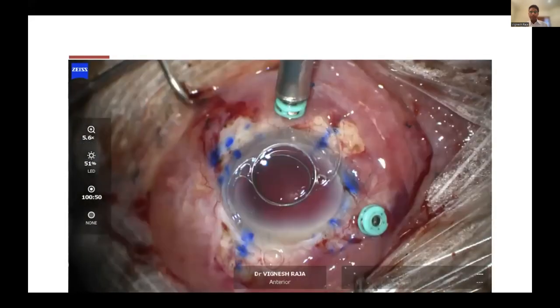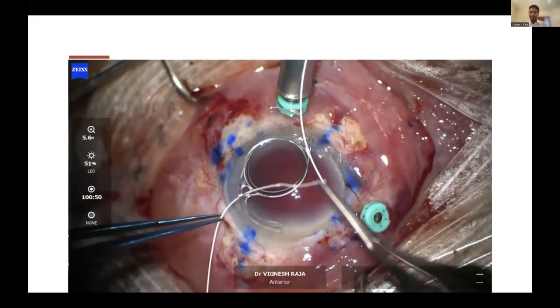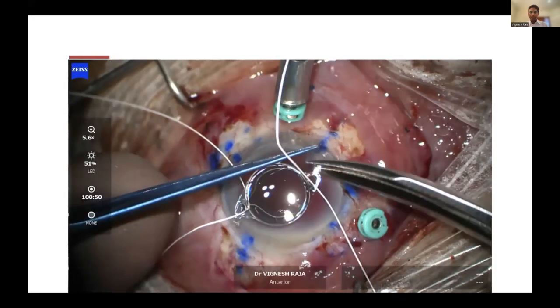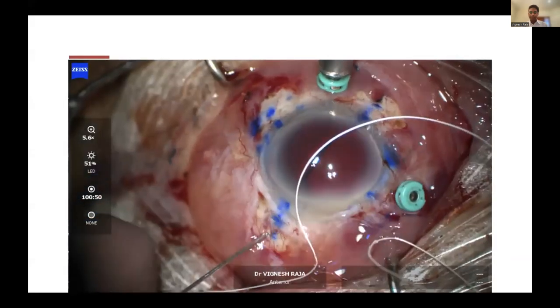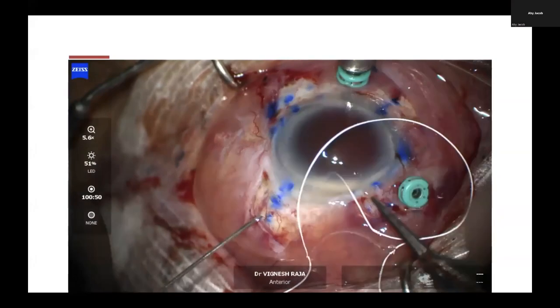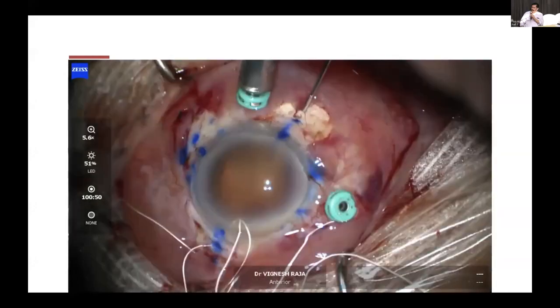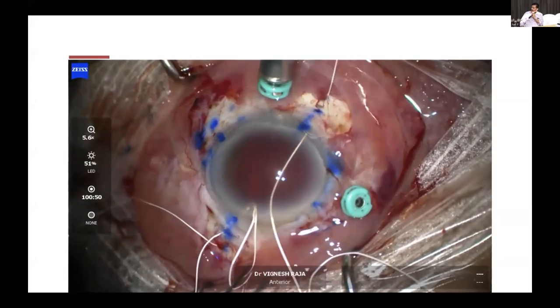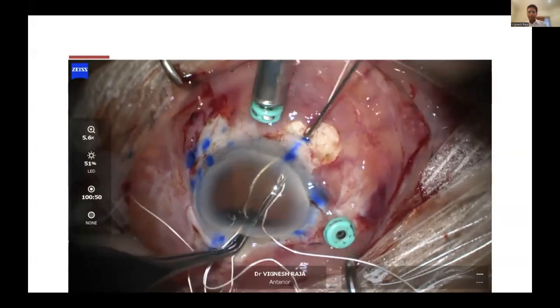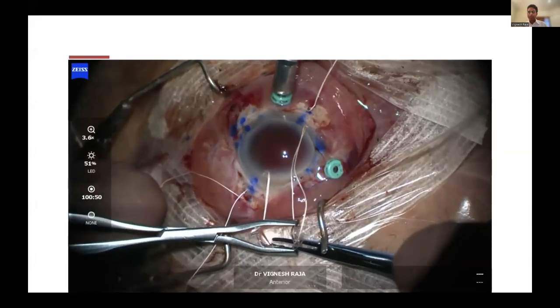Here, I'm actually scleral fixating a Bausch and Lomb Envista toric intraocular lens with Gore-Tex. I amputate the haptics off. This is a 25 gauge max grip. We could either use an MST 23 gauge max grip or a 25 gauge max grip. I'm just using a 25 gauge because then the sclerostomies are quite small.